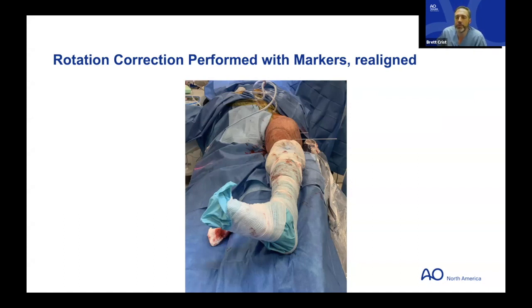But if it's a simple type fracture pattern, I'll try like 15 minutes before. I never bust out the F tool. I think that potentially does more soft tissue damage than a limited open reduction that's done well with limited stripping, like you said.